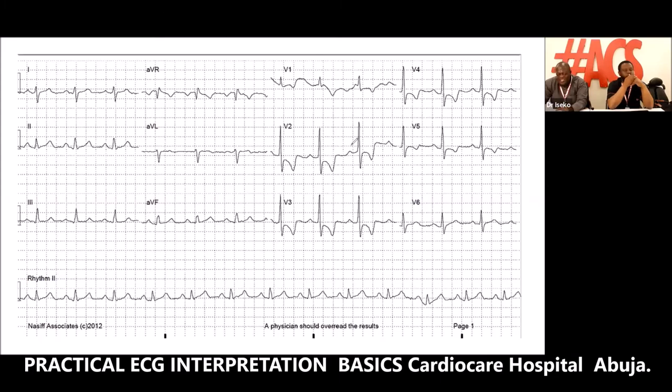So you can see that the same picture can be interpreted in different ways. One person will look at this ECG and say this, another person will say that. But by the time you bring the clinical presentation of the patient and marry it, you'll be able to say, okay, most likely this is what is happening in this case. Okay, let's go to another ECG.